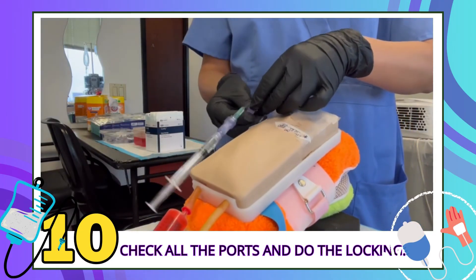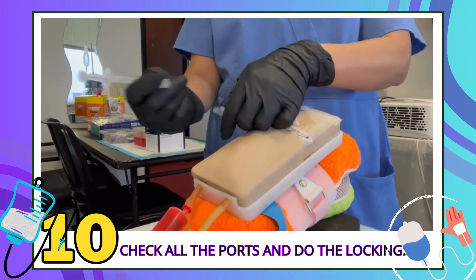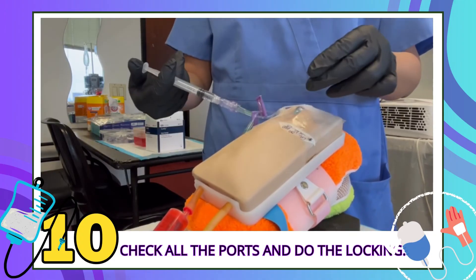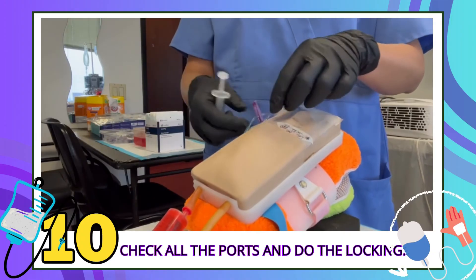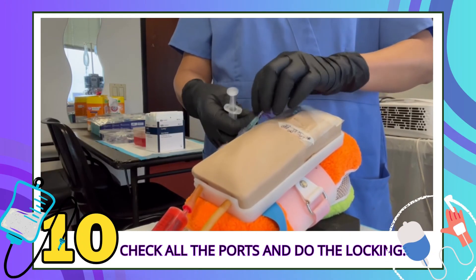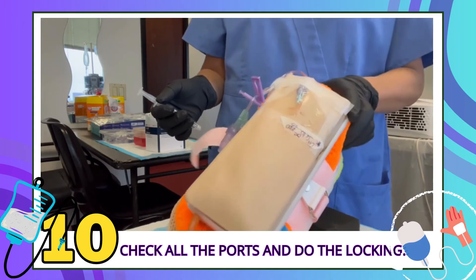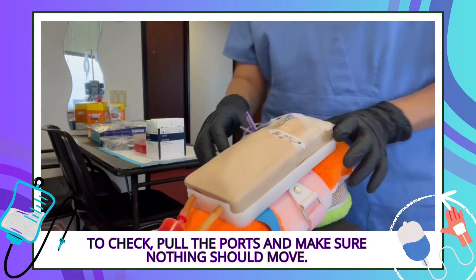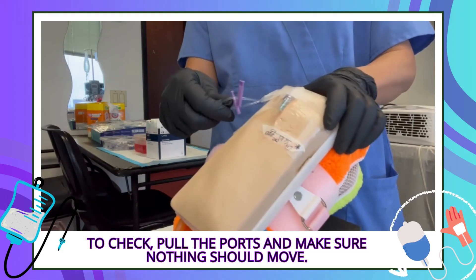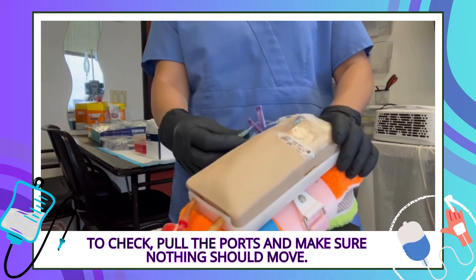Now you can do the lovely locking. I have a double port, so I'm going to check the other one. If you have a double port, you've got to check each one. To check, pull on your IV — nothing should move. Your IV should not move.